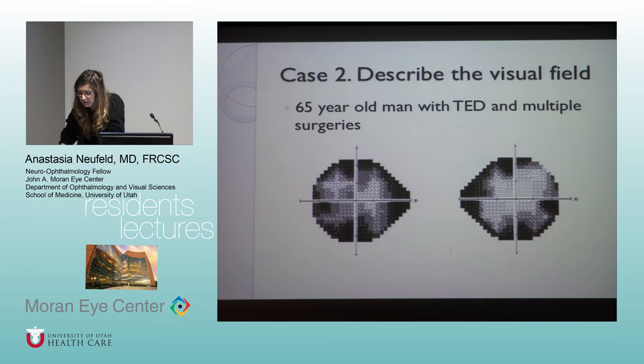Okay, so this is 10, this is 10, this is 10. Maybe it's too early to do math this morning, but. Well, it's 24, 10 on the other side. Sorry? Yes. So 24 and then 30. Mm-hmm. So a combination of it. Yep. It is too early to do math. All right. And so in the horizontal versus the vertical, you get 30 plus 24, 54 degrees.